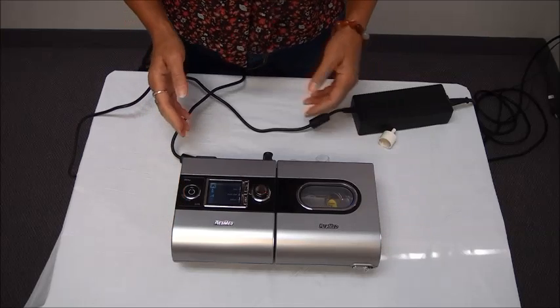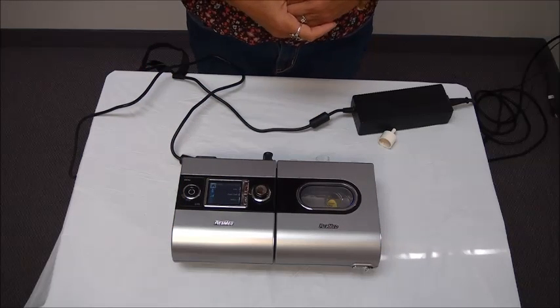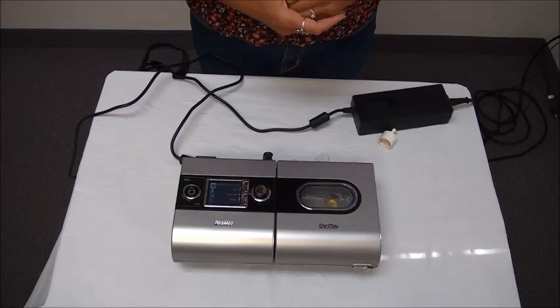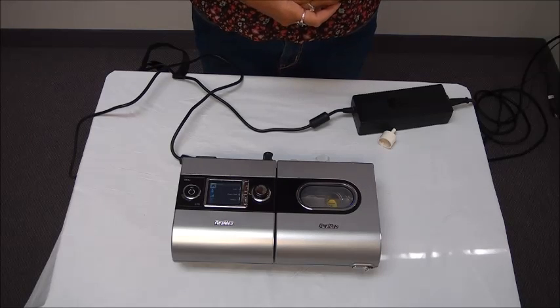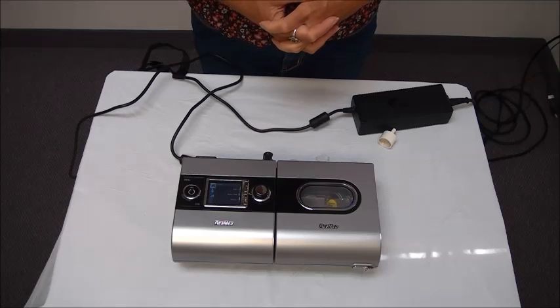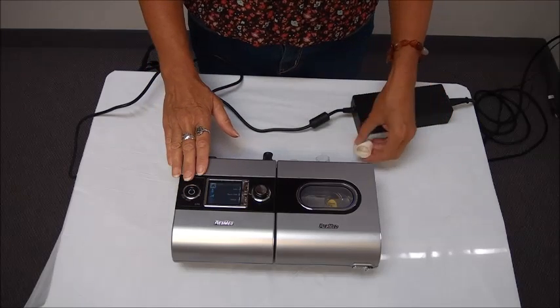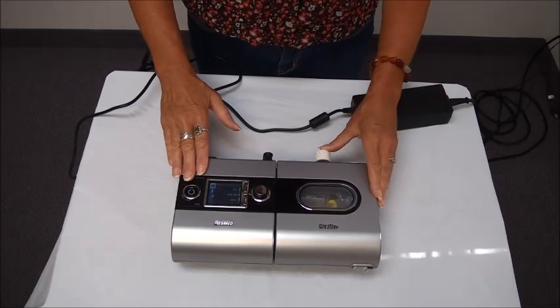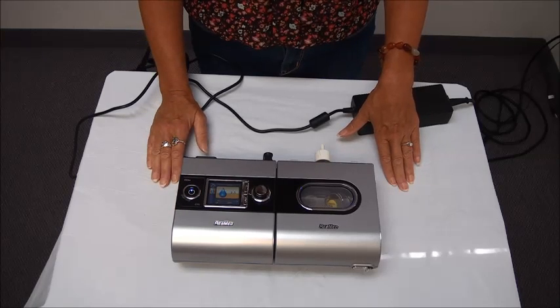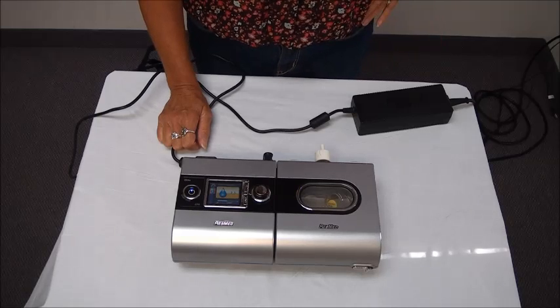Your doctor would order the pressures you need to be set up with on your machine and we would preset those for you. So all you really need to be able to do is know how to turn it off and on and adjust your heater. To do that, there is an on/off switch on the side — to turn it on you simply push the switch down and it will start working.